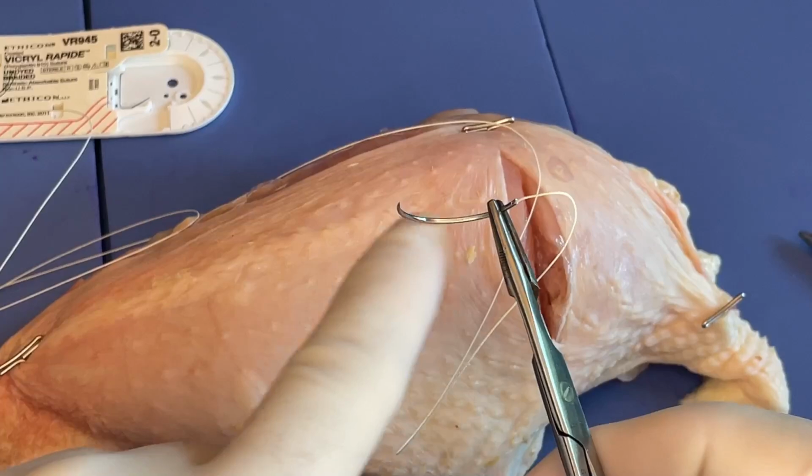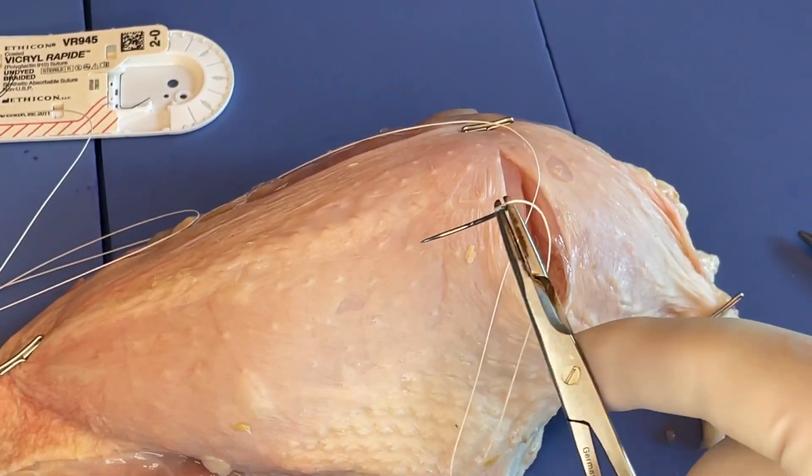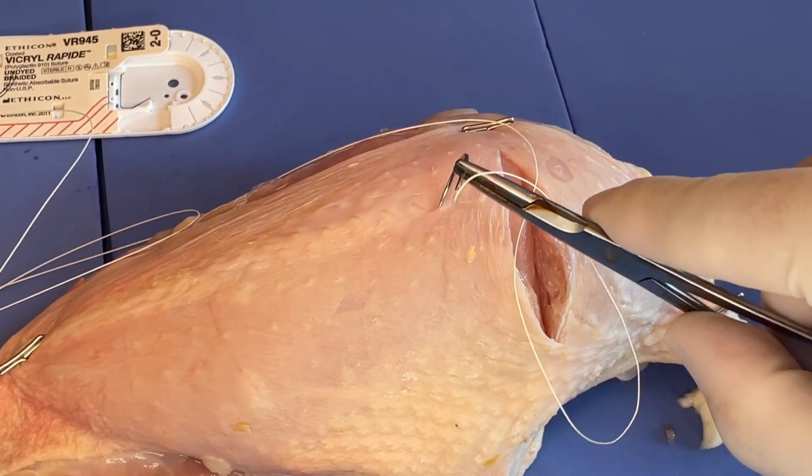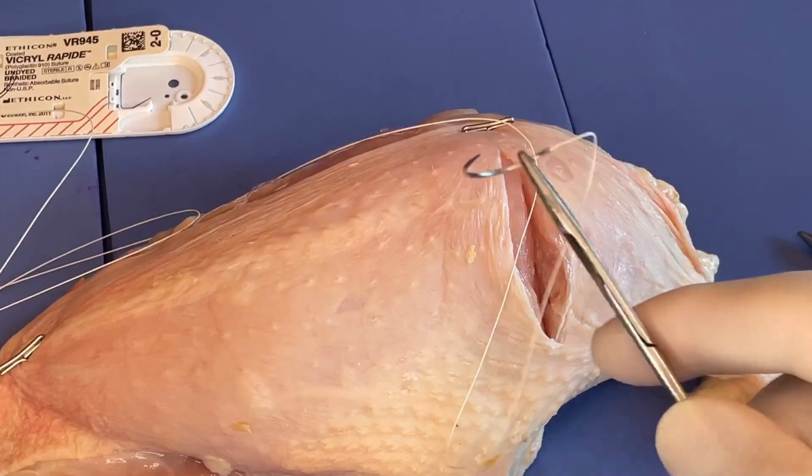Obviously, the further back you are on the needle, closer to the swedged end, the more you really have to crank your hand over to be able to get a good angle of attack on the tissue.